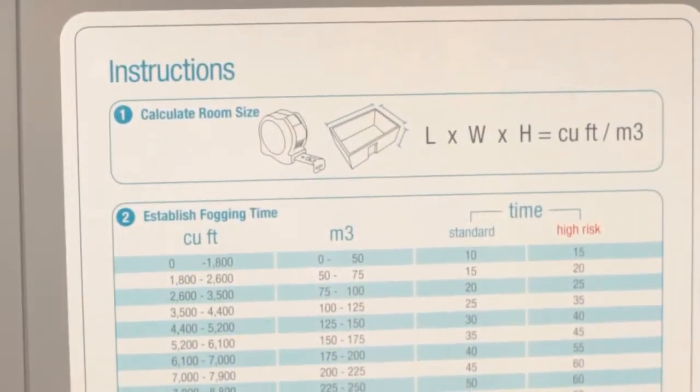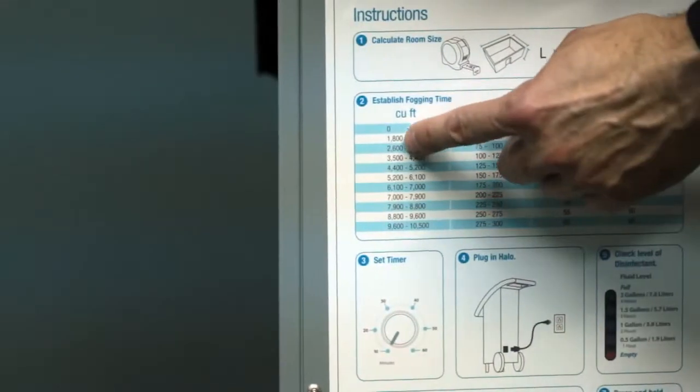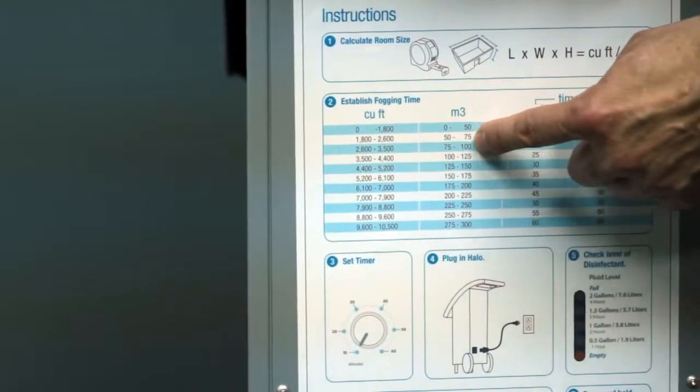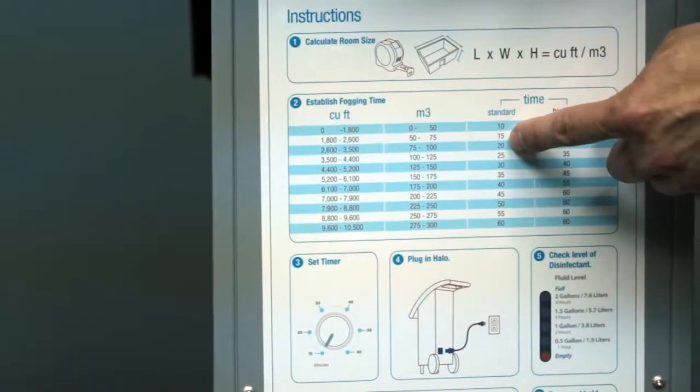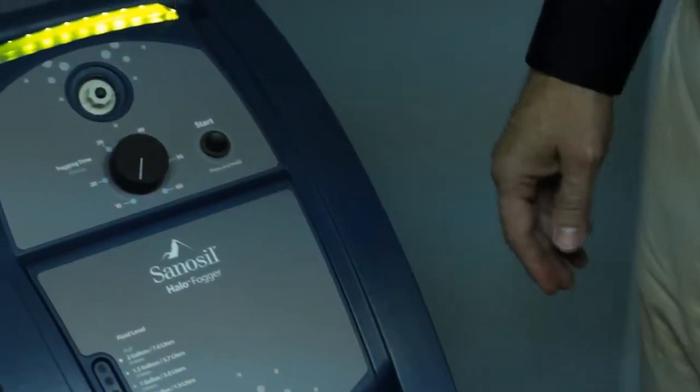On the back of the Halo unit and in the Halo's user manual is a fogging time chart. Determine the fogging time by finding your room size and its corresponding fogging time. Turn the fogging time knob on the front of the Halo to the desired runtime.